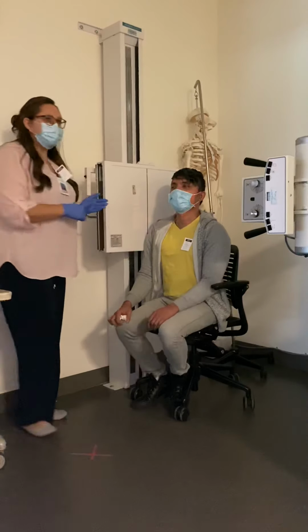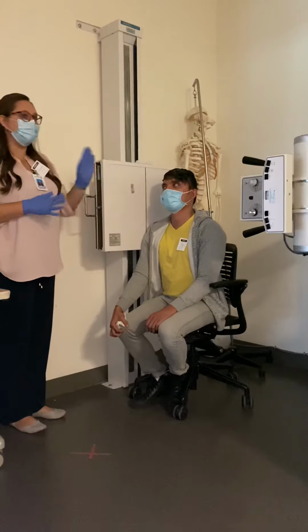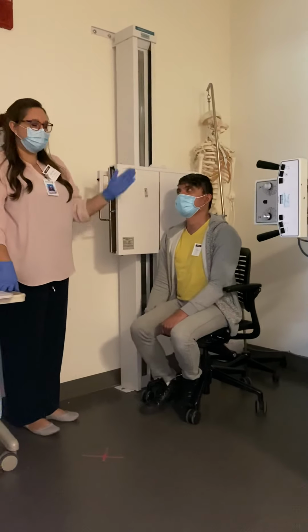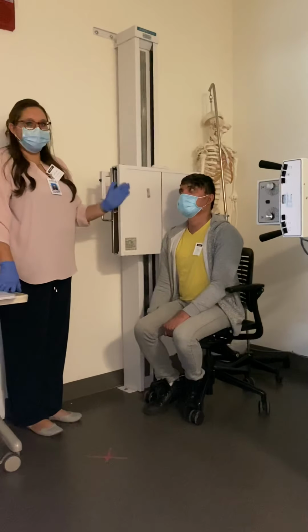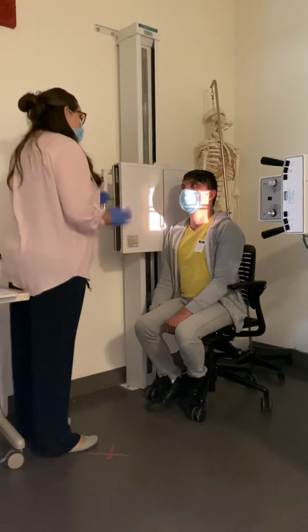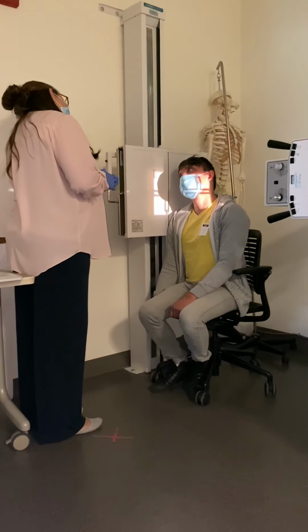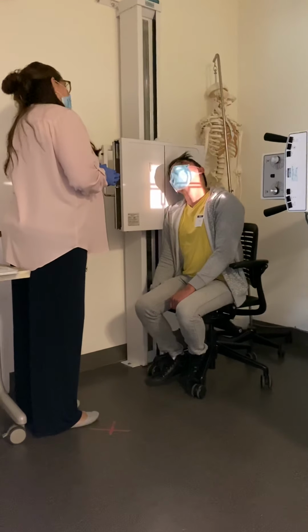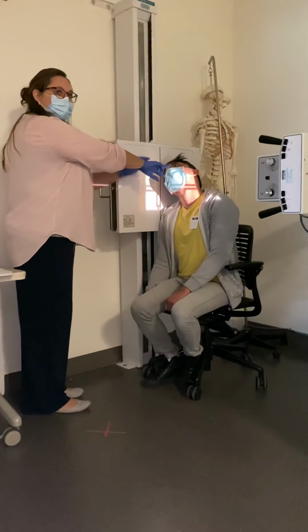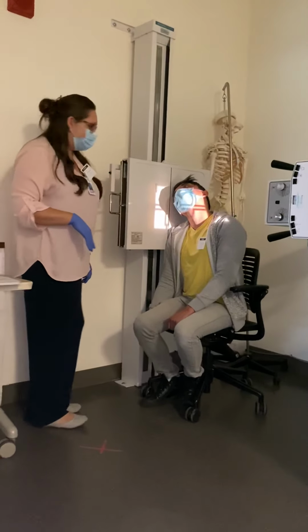The method that we use to get a general survey view of the mandible is to angle our patient. Some of them you want to put a 25-degree cephalad angle on the tube, but what we're going to do is just angle the patient. So keep that space to have OID, and then tell your patient, tilt your head in until it's touching, kind of laying on the board, and then bring your chin up for me. What we're doing with that is tipping the mandible up so we can get the upside out of the way so we can visualize the downside of the mandible.